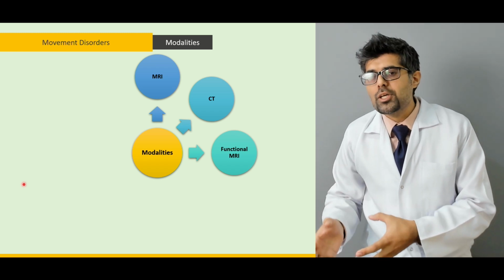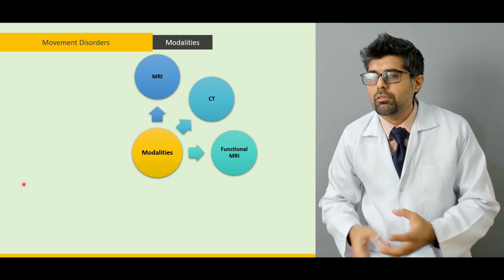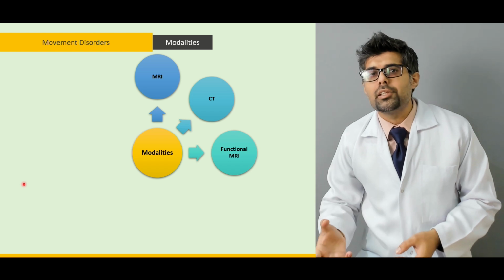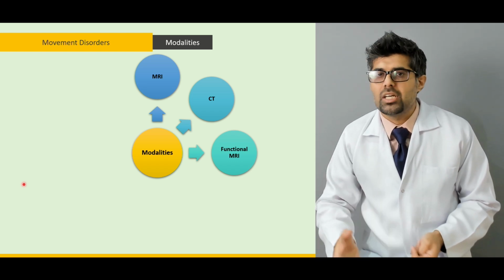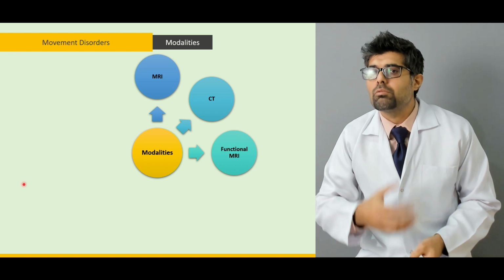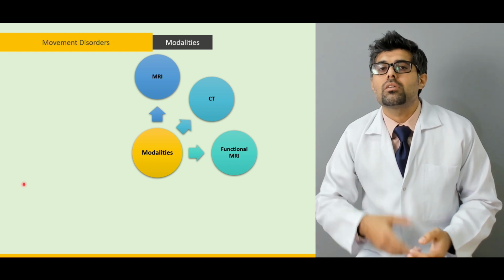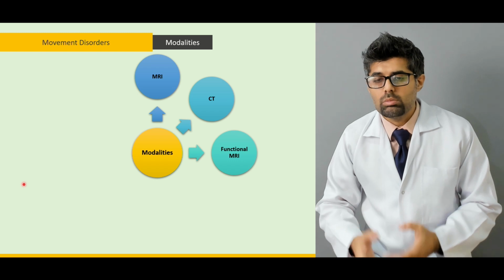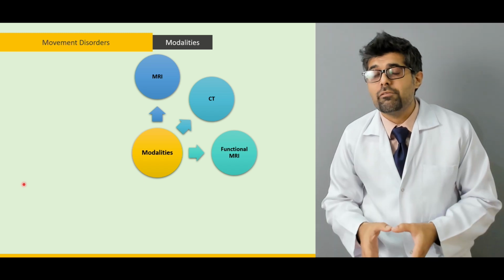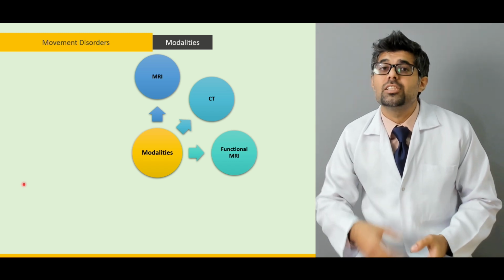So whenever a patient with movement disorders is not producing some kind of movement, or something is inhibiting that movement, that center will also show inhibition. That center will not show any involvement, or will be totally uninvolved during the production of movement, even if the patient tries to move. So functional MRI is a highly advanced form where we observe the live feed of the patient's brain whenever he's producing a particular movement, or at least he's trying to.